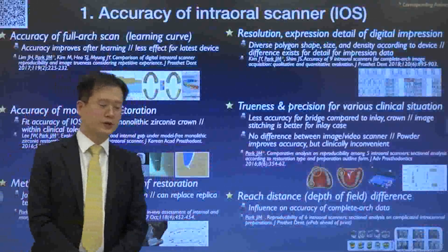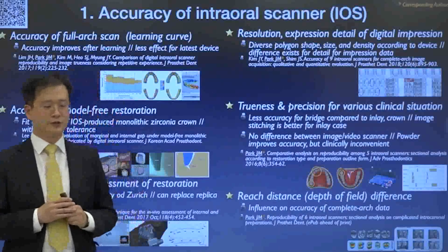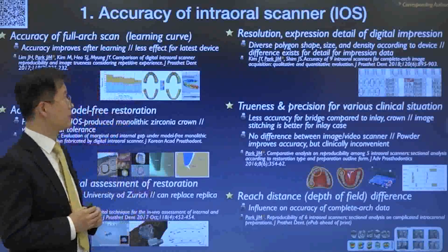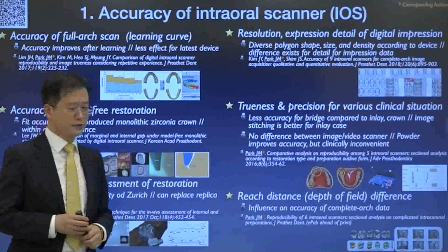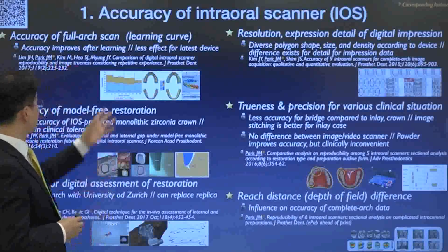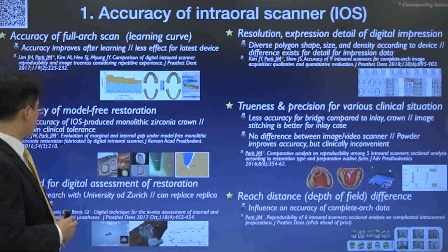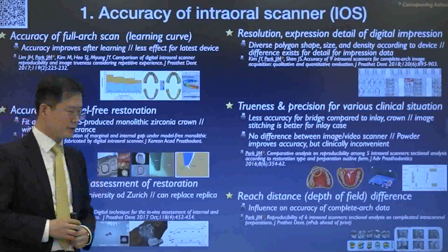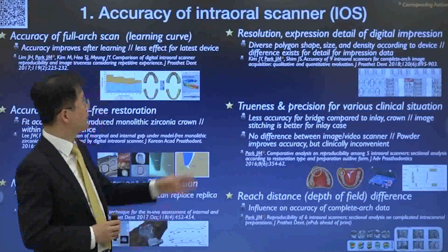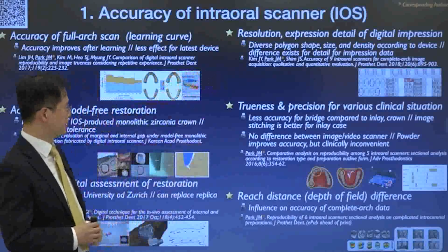For those who are interested in my many digital usages above, please feel free to download my research articles. I did some research on the accuracy of the intraoral scanner, such as accuracy of complete arch scan, learning curve, and accuracy of model-free restoration, and new digital assessment techniques for clinical study, and resolution and expression detail of digital impression body.